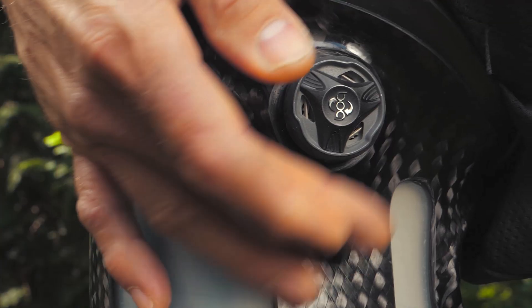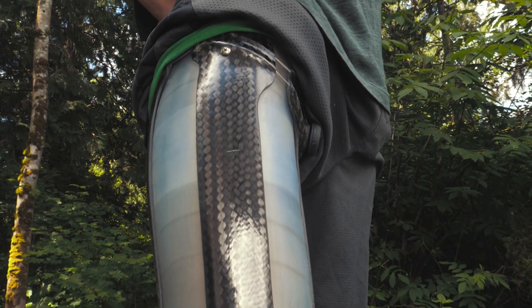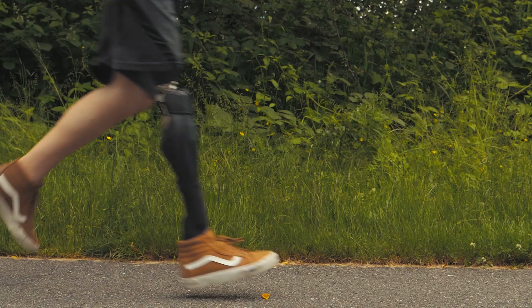The Hi-Fi Socket also provides a great sense of proprioception so that as an amputee is walking, they feel more connected to the ground.